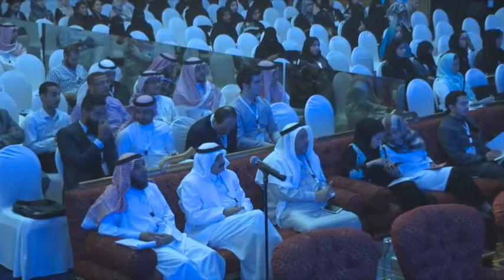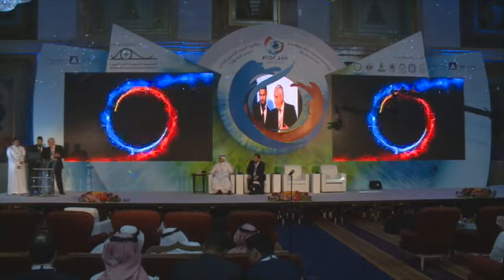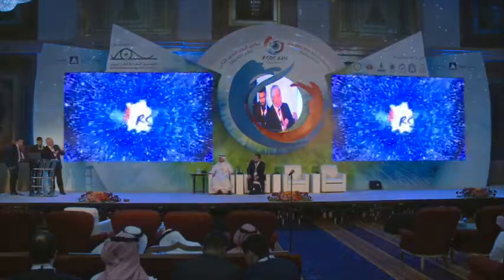I also disagree a little, because best fit sphere is much better to see ectasia, protrusion, or a bulged surface. The maximum amount of BFS will tell you how tall is the peak of the mountain. But best fit toric aspheric or ellipsoids are perfect to see the asymmetry of the surface, not by observing the maximum value, but the difference between the minimum and the maximum value. This delta will give you how asymmetric the surface is. So both types of maps are perfect to see different things, as we are going to try to show you.